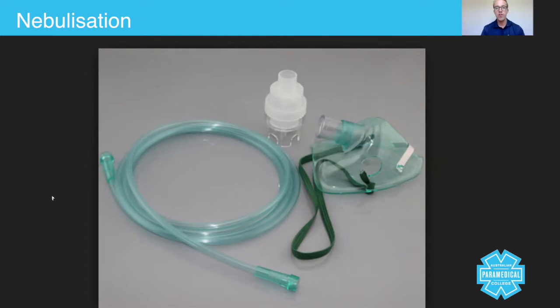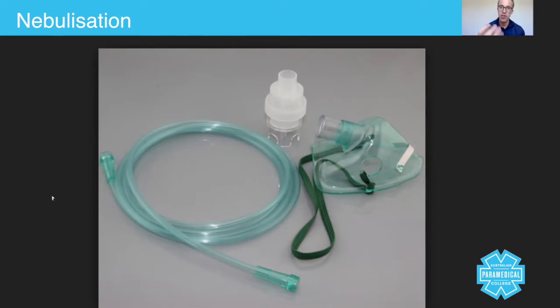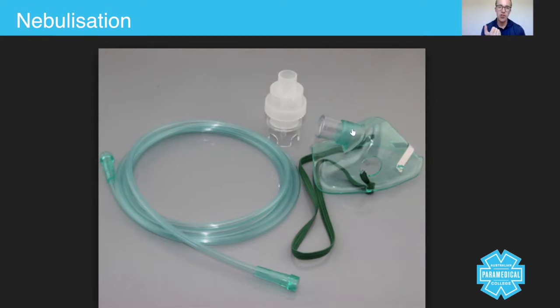Once you've connected it all and you've gone through your drug checks to make sure it's the right drug and the right dose, you then turn the oxygen on until you get a fine mist.